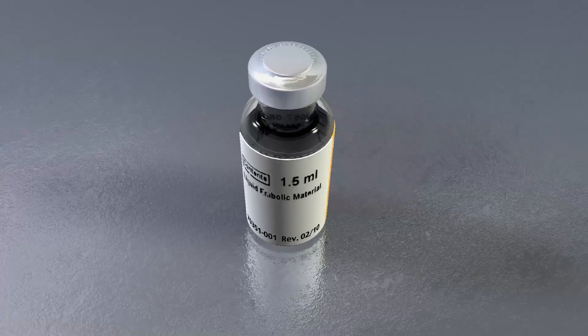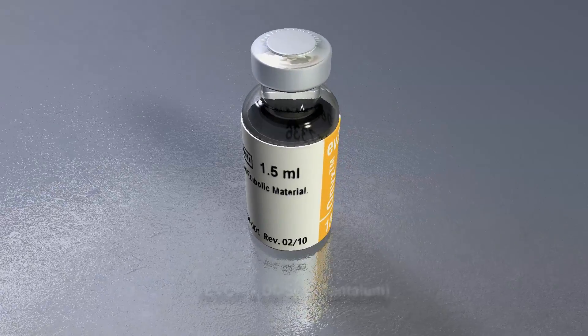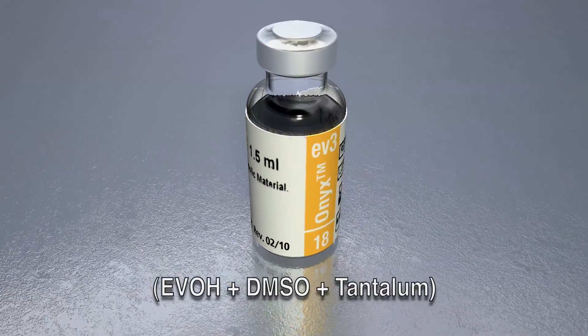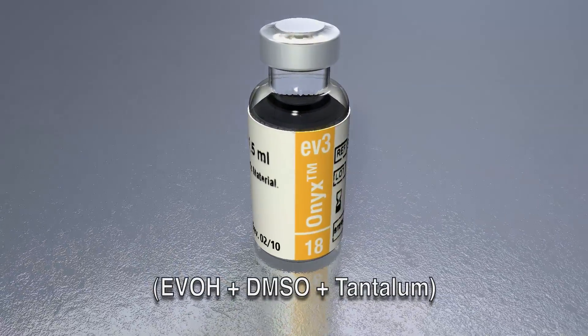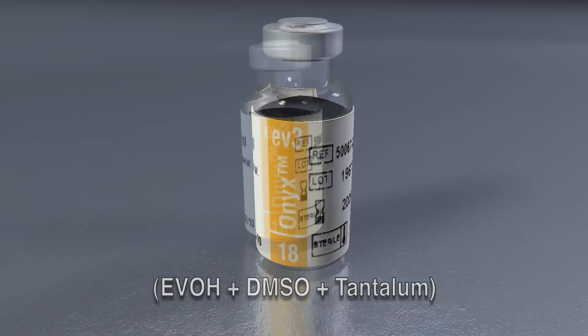Onyx is a non-adhesive liquid embolic agent comprised of ethylene vinyl alcohol copolymer (EVOH), dissolved in dimethyl sulfoxide (DMSO), and suspended micronized tantalum powder to provide contrast for visualization under fluoroscopy.